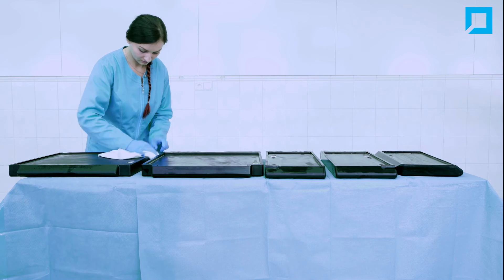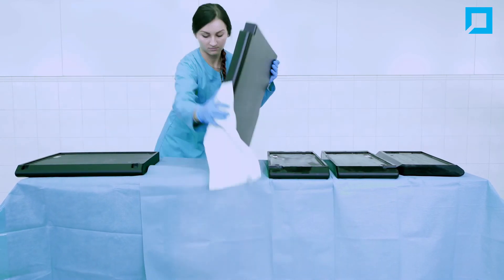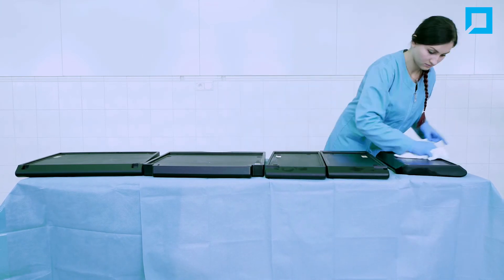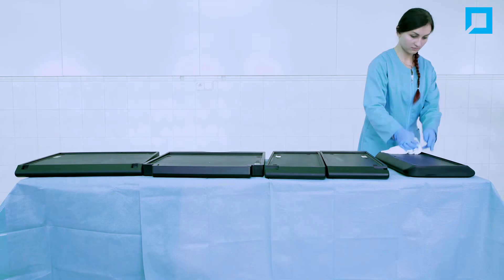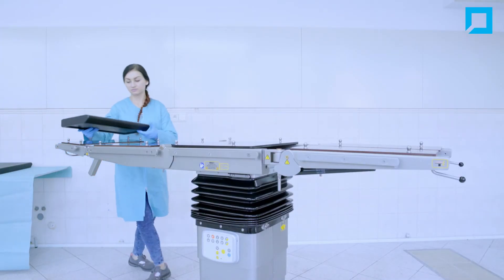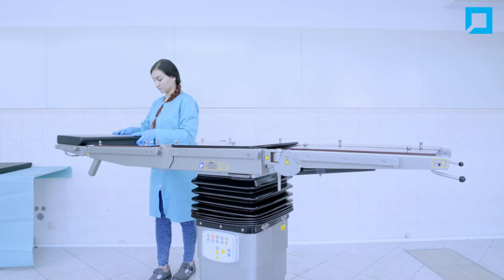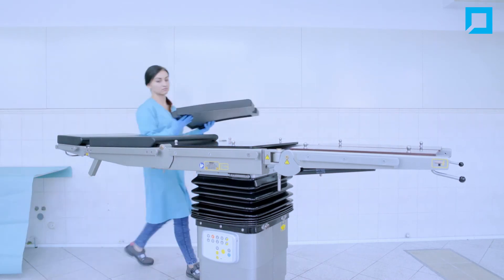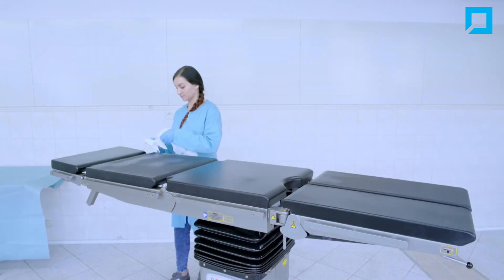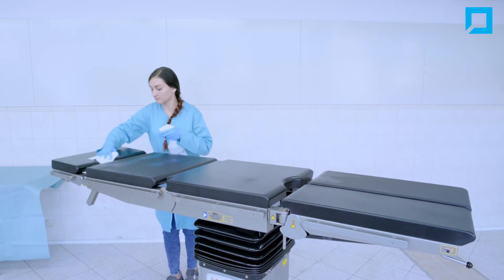Wipe the mattresses dry. Put the mattresses back on the table. Preserve the mattresses with a protective agent, for example Neoplan.